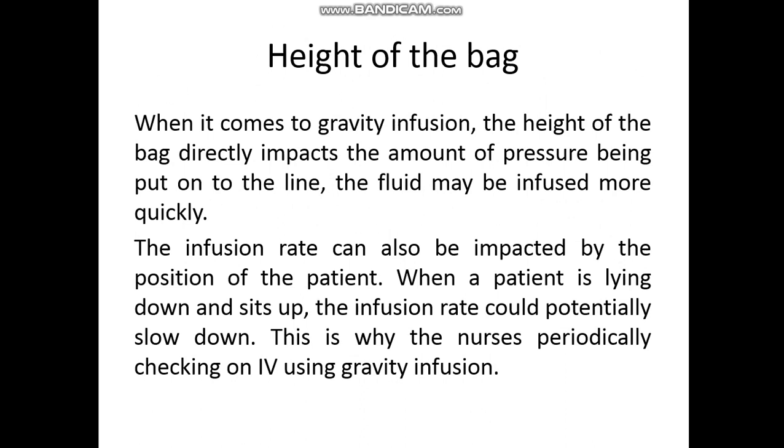So for the action of gravity, the height is very essential, because it affects the pressure applied on the line of fluid, so that the medication can be infused very quickly. Okay. The infusion rate can also be impacted by the position of the patient. If the patient is lying down or in a sitting position, the infusion rate could potentially slow down.